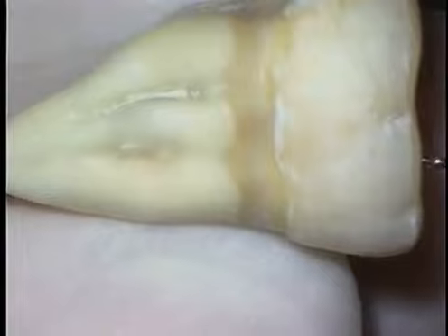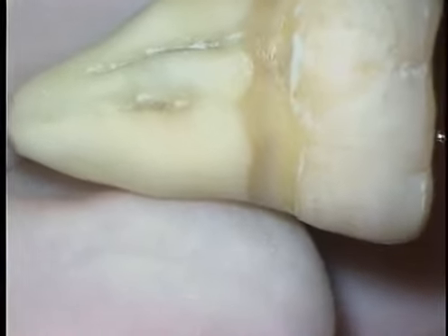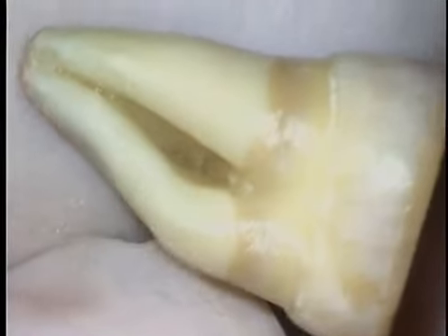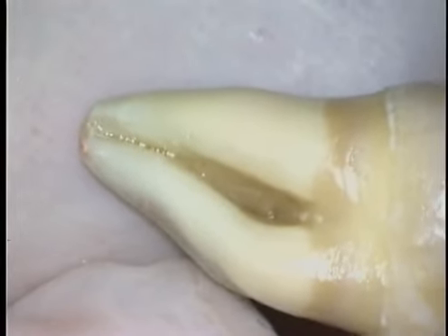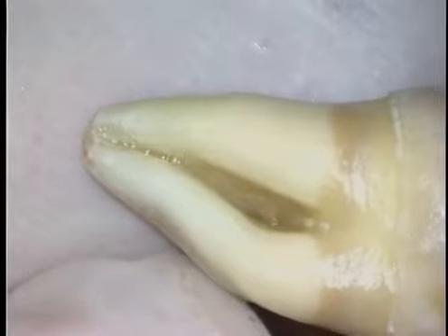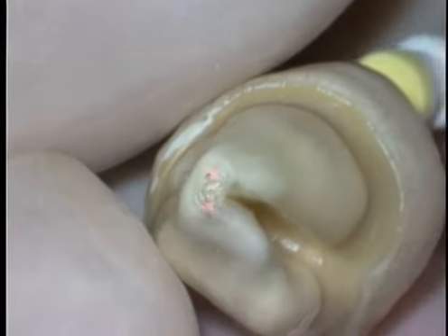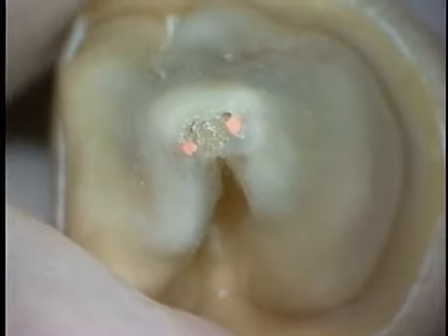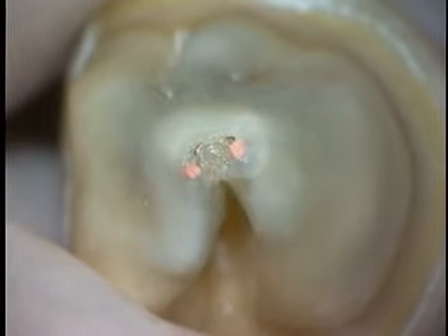Looking at the C-shaped molar extraorally reveals its anatomy. Notice the fused roots. Notice that as we move down towards the apex and turn the tooth around, we see the cul-de-sac furcation towards the lingual aspect. If we look right up on the end of the root, you can begin to see within the sheath or isthmus that follows the configuration of the root, there's gutta percha at the extents of this fin. Notice the dead space in between the two gutta percha points. Therefore, many times, the pulpal floor anatomy reflects the anatomy that we see at the end of the root.